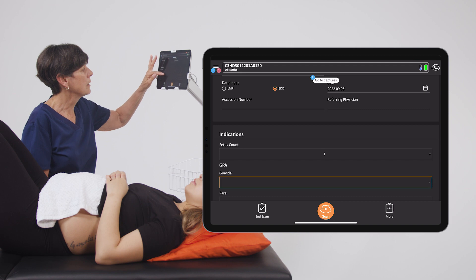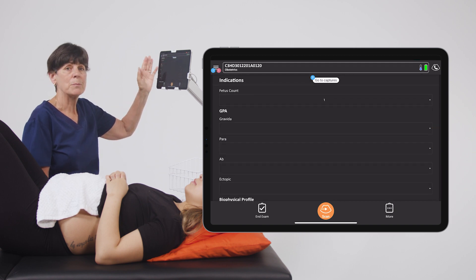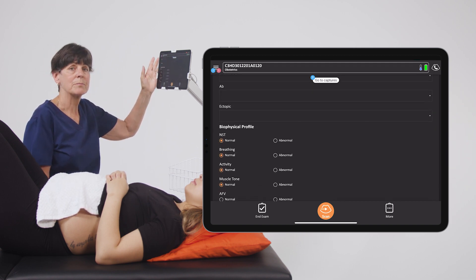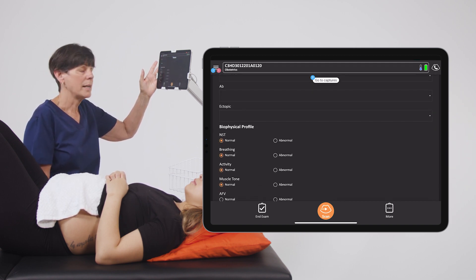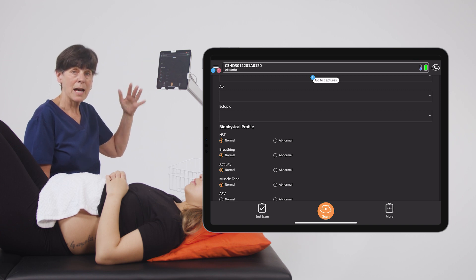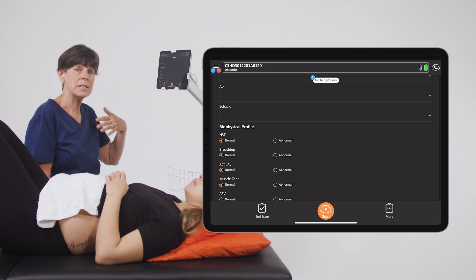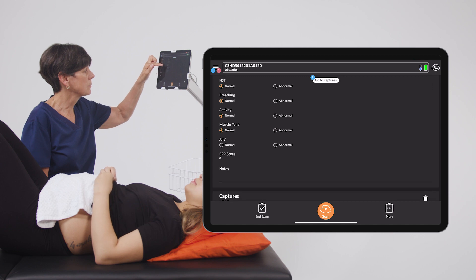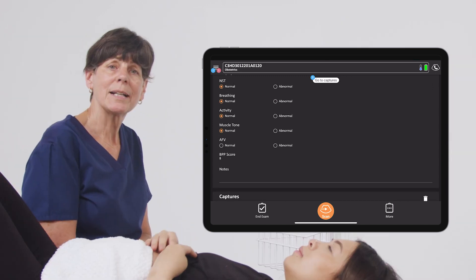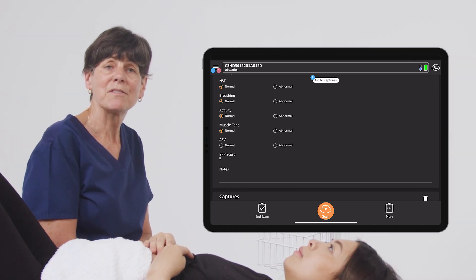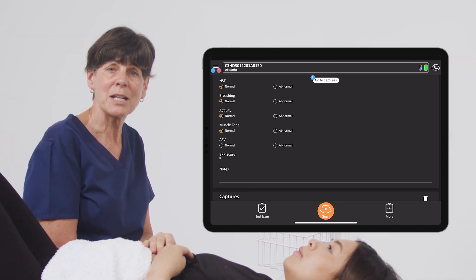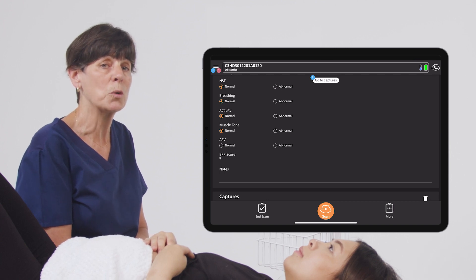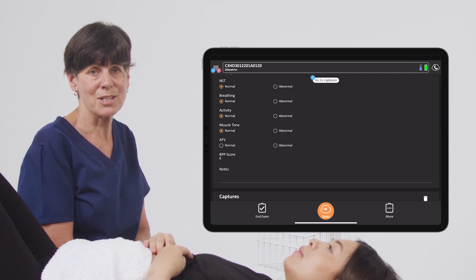We also have the ability to enter biophysical profile scoring, and you can do this at any time during the exam when you need to enter the right score. So populating the demographic information will provide you useful information once you've completed all of your OB measurements and evaluations.